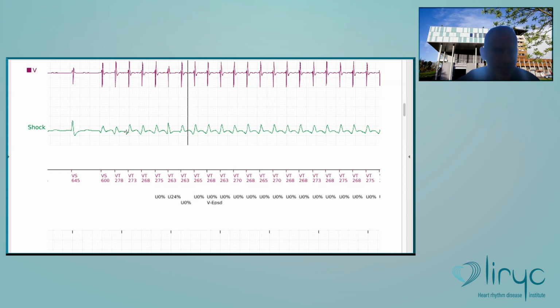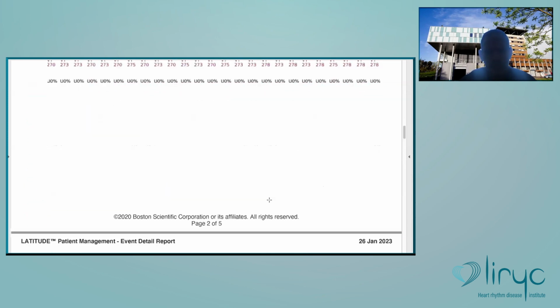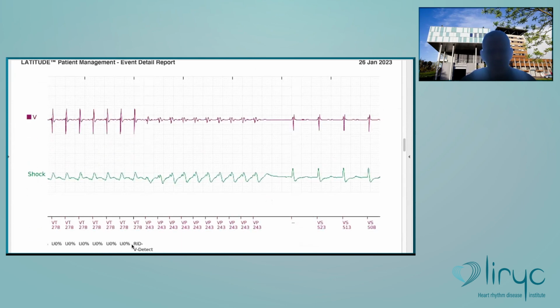It's also an 8-point analysis in Abbott and in Boston, but where exactly these 8 points are located seems to be different in Abbott and in Boston, and this will have implications. So here it's a VT. You see the percentage is very low, so it's not correlated, and at the end, it's going to be treated.